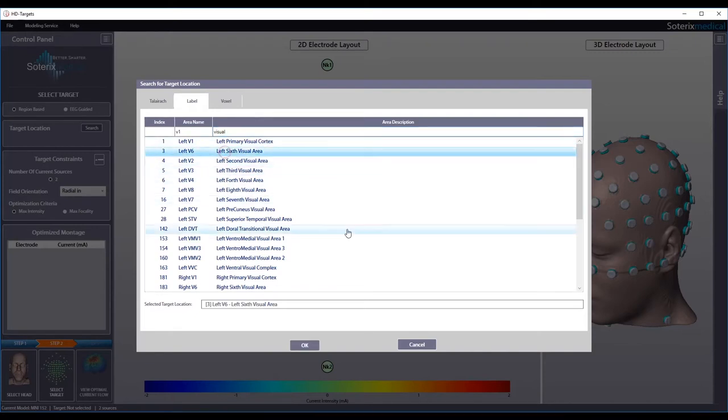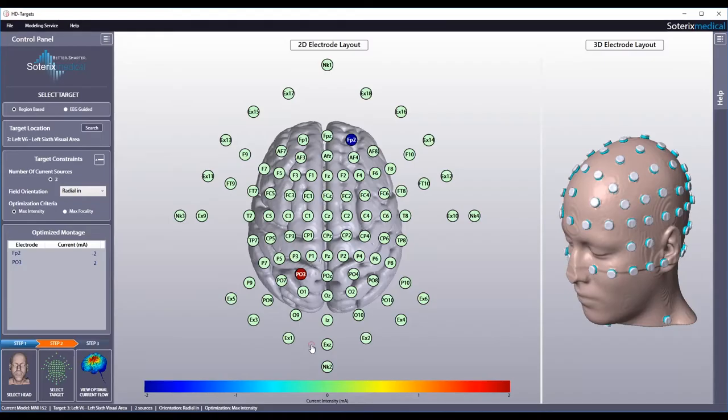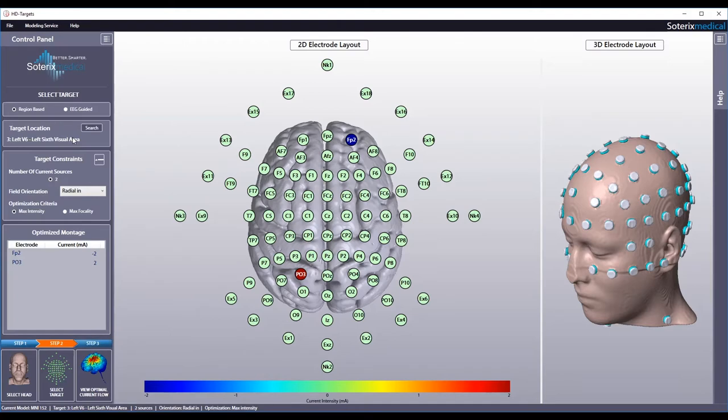Let's select region V6 visual area. Note that the target location is selected automatically and entered in the target location box. Next, select your constraint starting with the optimization criteria.